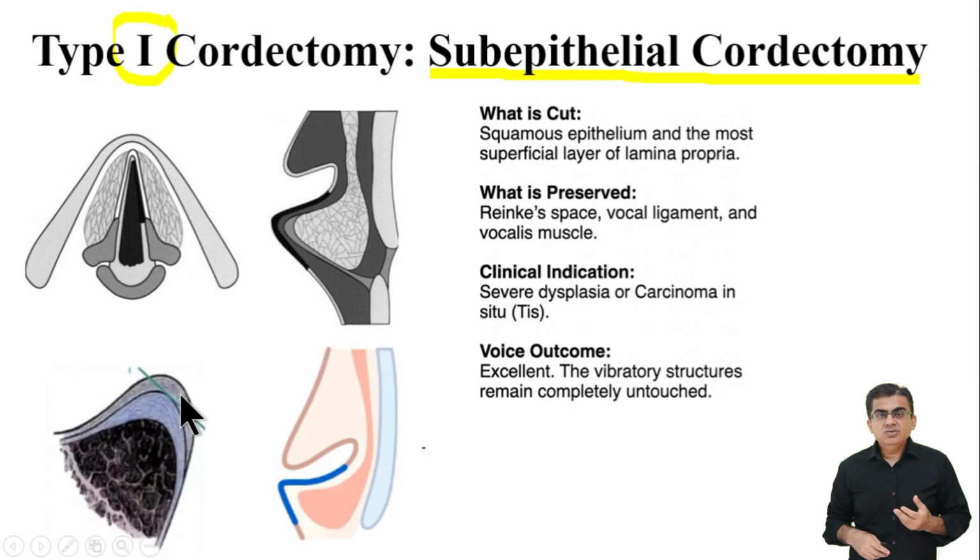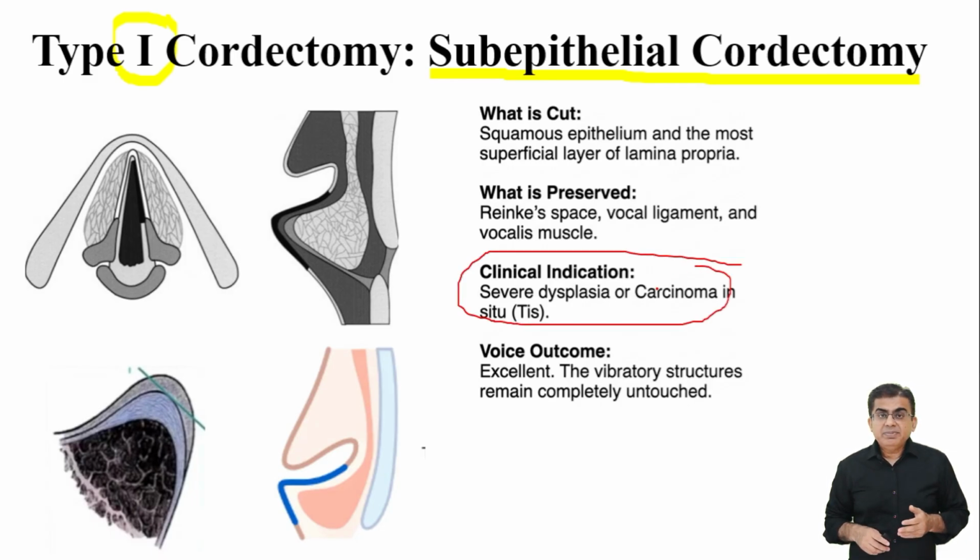When do we strictly use this exact resection in the operating room? It is exclusively reserved for very early and highly superficial lesions. This primarily includes severe dysplasia and carcinoma in situ.